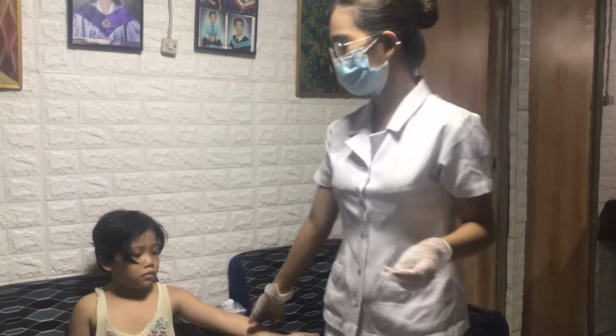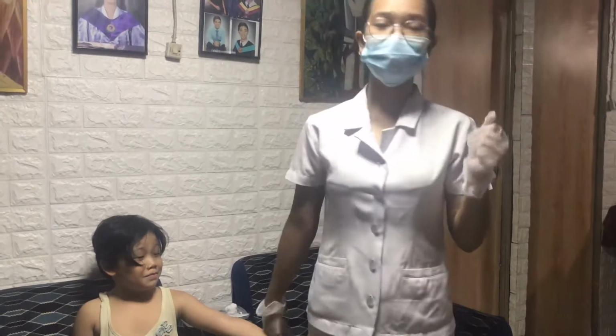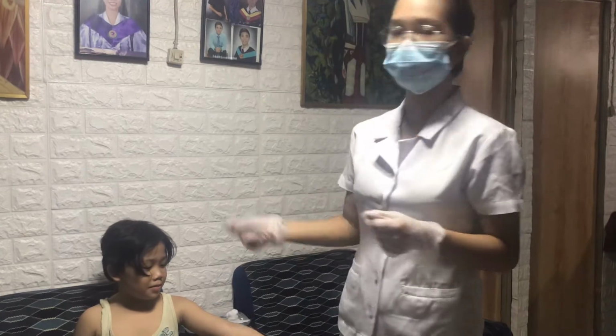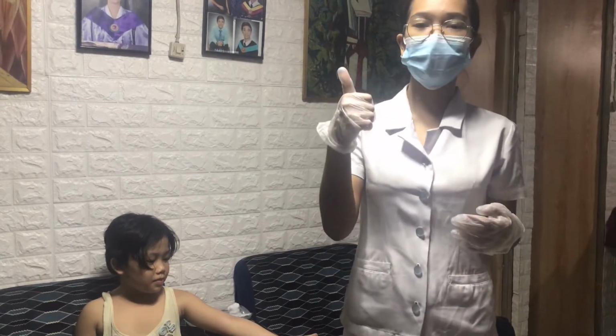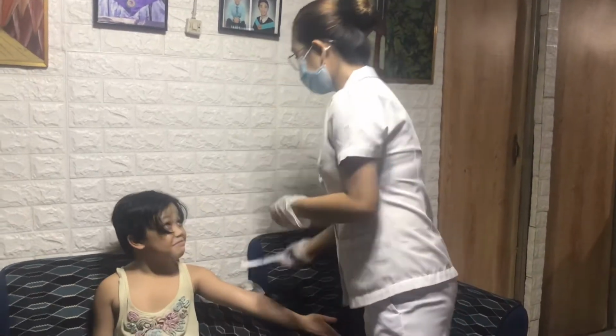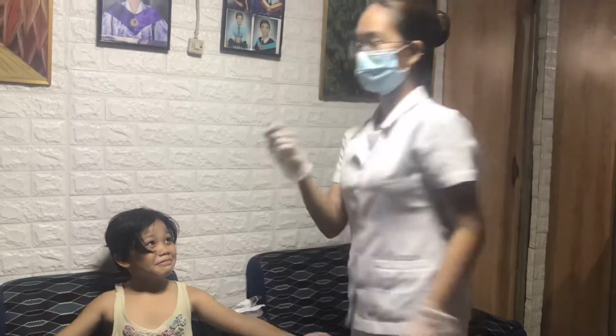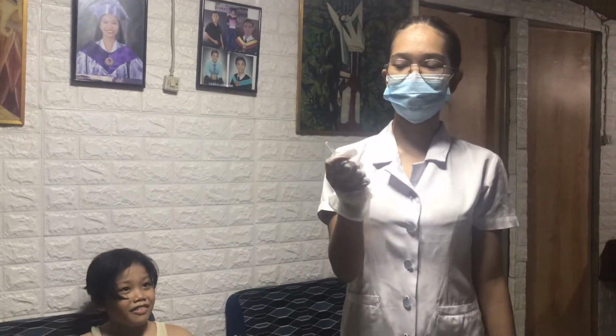Next, after using the antiseptic swab, remove the cap and hold the syringe between the thumb and forefinger of your dominant hand with the bevel of the needle pointing up. So I will be holding the syringe, and I will be removing the cap.